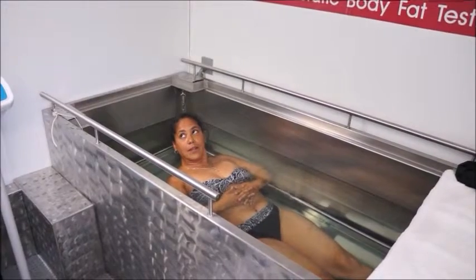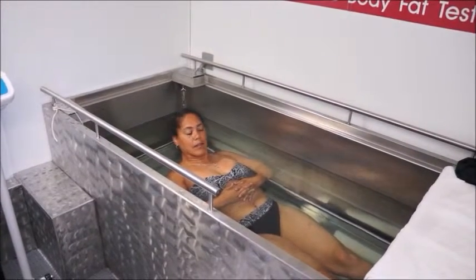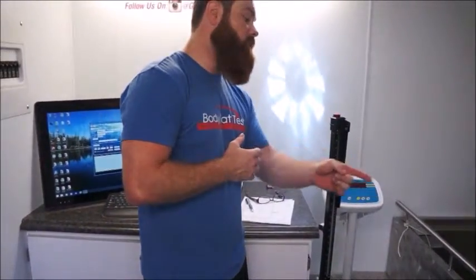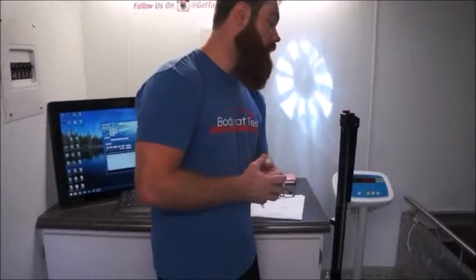When you feel like you need to come up, just come up. Make sure you blow your nose when you go under. And you can use a rail to help pull yourself under.